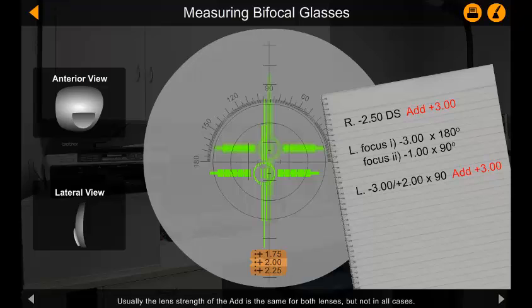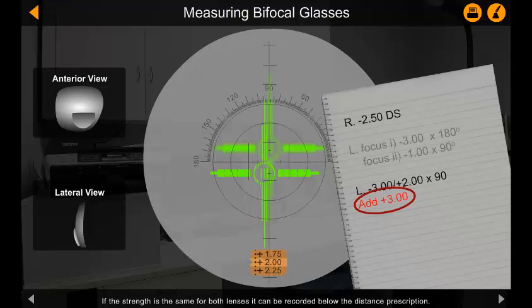Usually the lens strength of the add is the same for both lenses, but not in all cases. Regardless of the type of lens, if the strength of the add is different for each eye lens, it needs to be recorded next to each lens prescription. If the strength is the same for both lenses, it can be recorded below the distance prescription.